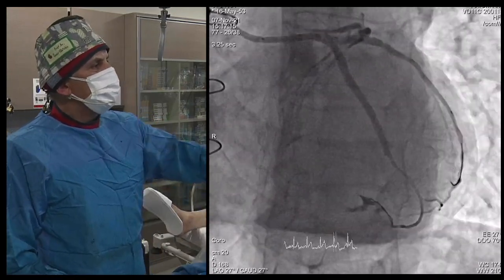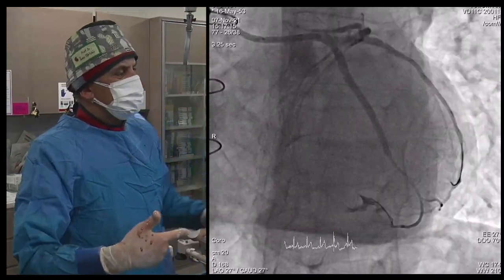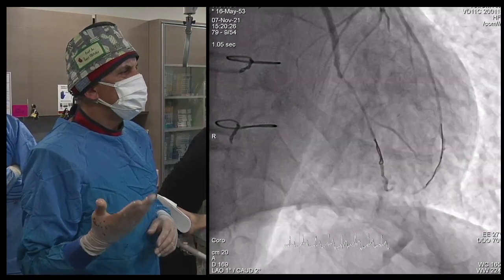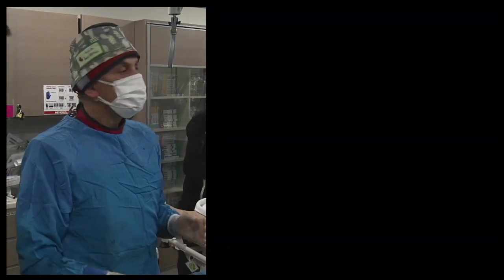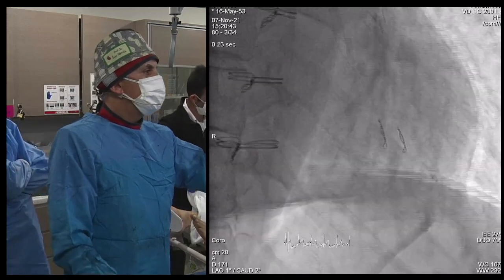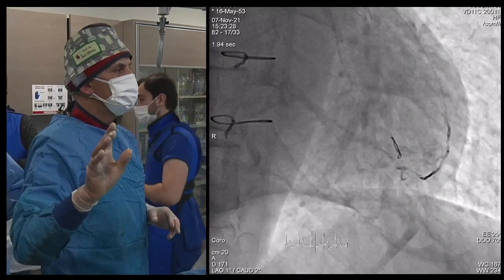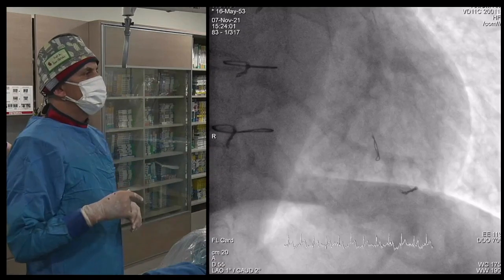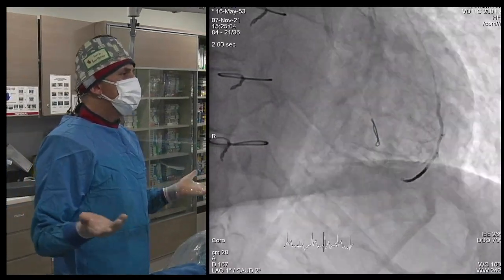We thought it's better to heal this. We have two ends of the perforated vessel, so we coiled both. We did a tip injection on one side. We placed a micro coil, then another one, and really closed that gap — I'm sure it will be totally occluded within minutes. We also addressed the other branch since there are two ends to this collateral and both need to be closed.